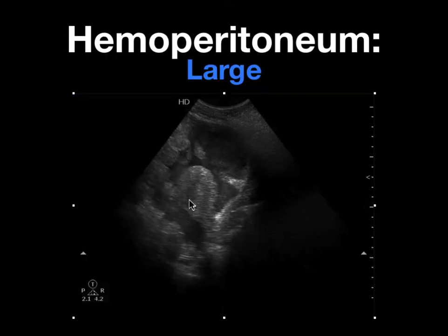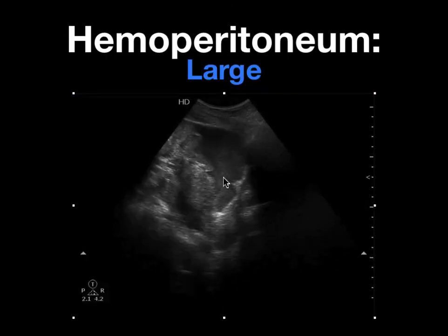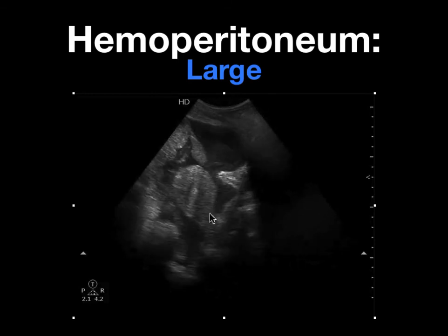Here's a patient that has a very large amount of hemoperitoneum, and it's all complex. If you look here you've got the uterus. It's anteverted here. You can see that there's triangular corners here as the fluid is interacting with the bowel the whole way around the uterus.